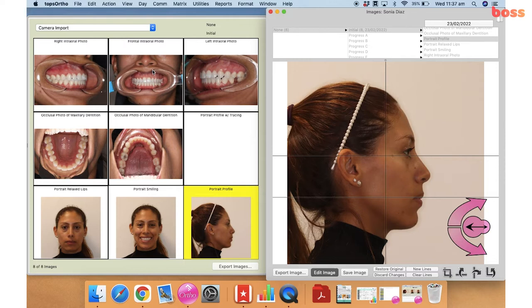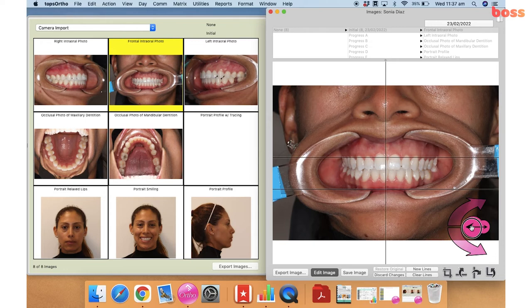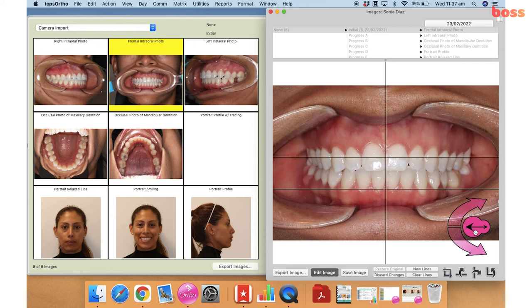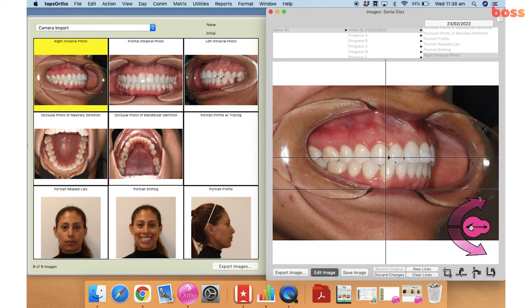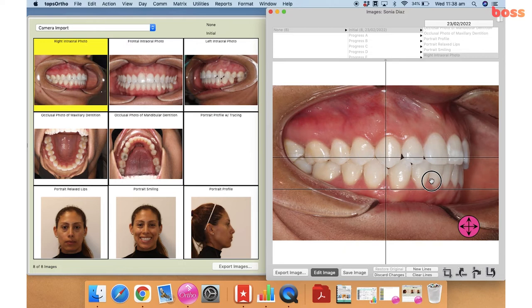Now we're going to go into the intraoral photograph. Here you can see that the occlusal plane is parallel to the floor. What I'm going to do is just zoom into this image, center it, and then it's ready to be saved.